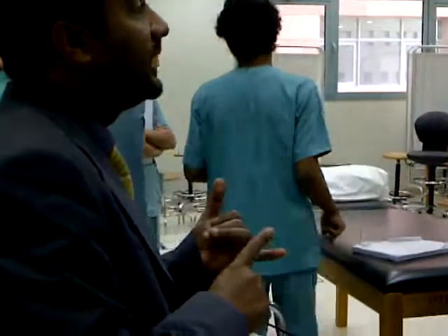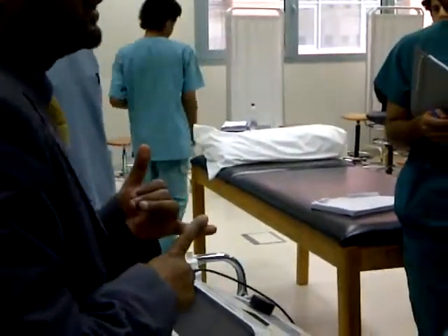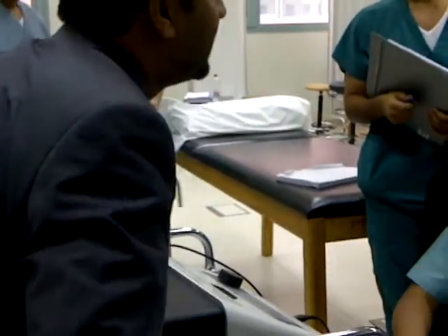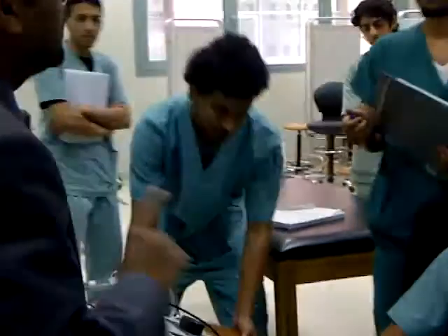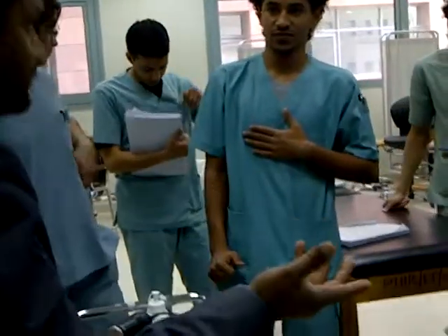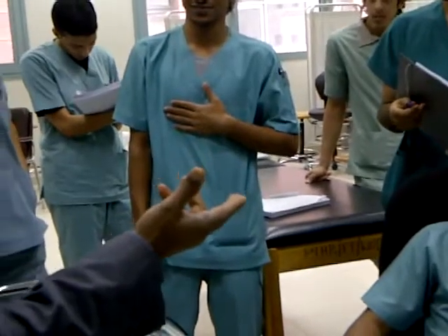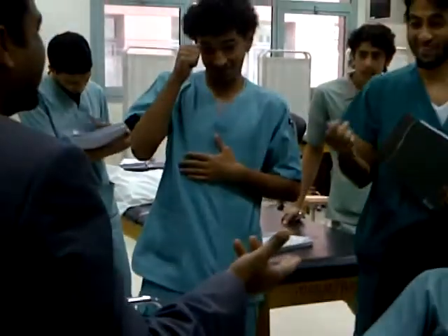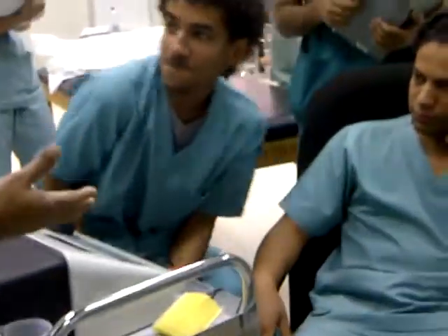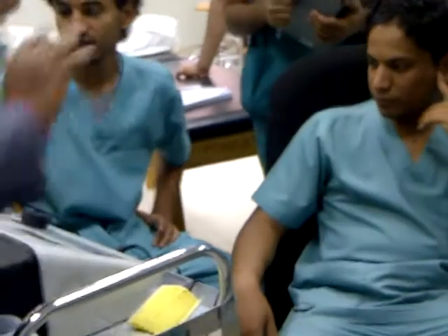Whenever you are dealing with ultrasound, if you are giving 10 or 15 minutes, do not stand and give. If you stand, you have to bend your back and it will hurt your back. That is not proper biomechanics, it is wrong biomechanics. Use your common sense. So keep a sitting position which is comfortable, close to the machine and close to the patient.